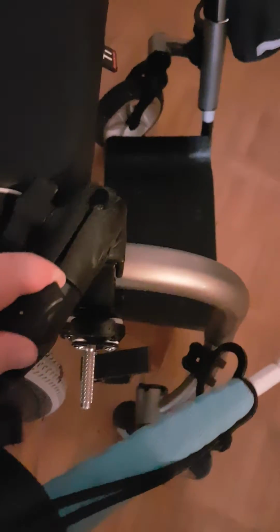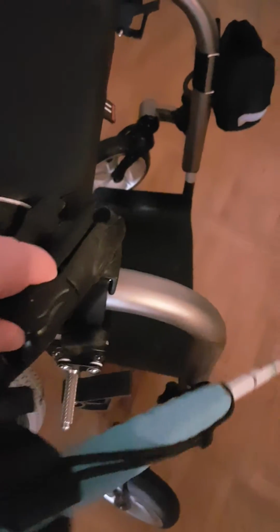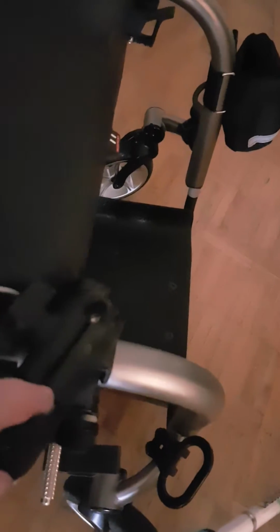There's my center joint. That's actually the swivel joint. That's the part that actually swivels. The one part that's actually supposed to move. And then here's the second arm on the other end of the swivel arm. And that's the one attached to the ball on the clamp attached to my seat tubing. Okay, and I'll show you the swivel arm again.